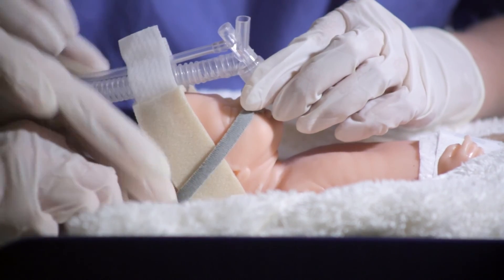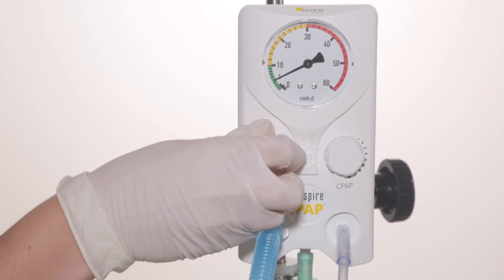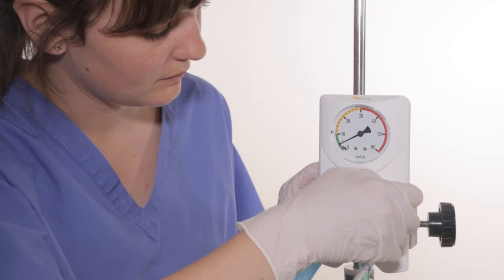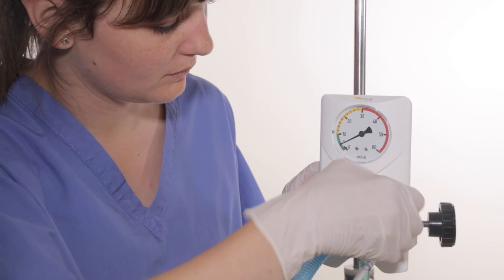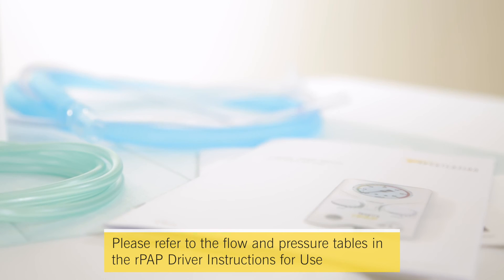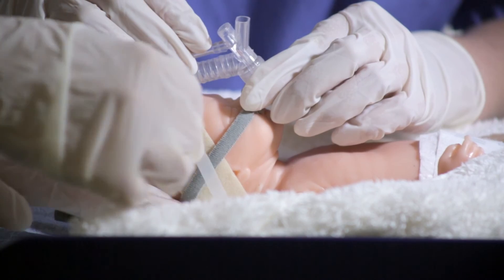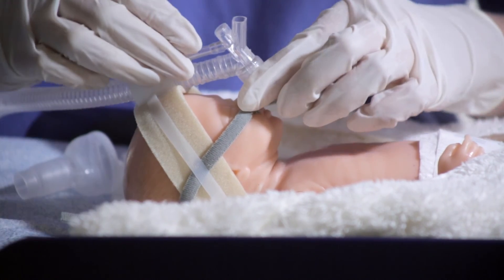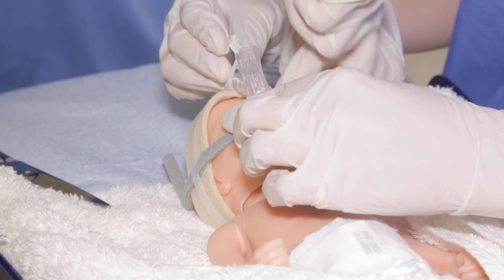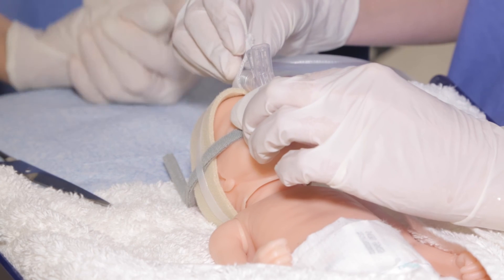Place the felt straps either side of the headband and secure using the additional velcro strips. Turn down the PIP control knob to the minimum setting on the RPAP driver. Adjust the flow meter and set the CPAP to the desired pressure. Please refer to the flow and pressure tables in the RPAP driver instructions for use to set the prescribed pressure for the infant. Take care to ensure that the infant is comfortable and that the infant's vision is not obscured. Make sure that the straps are not too tight against the skin and check the RPAP generator is positioned correctly. The infant is now ready to be transferred safely to the NICU.